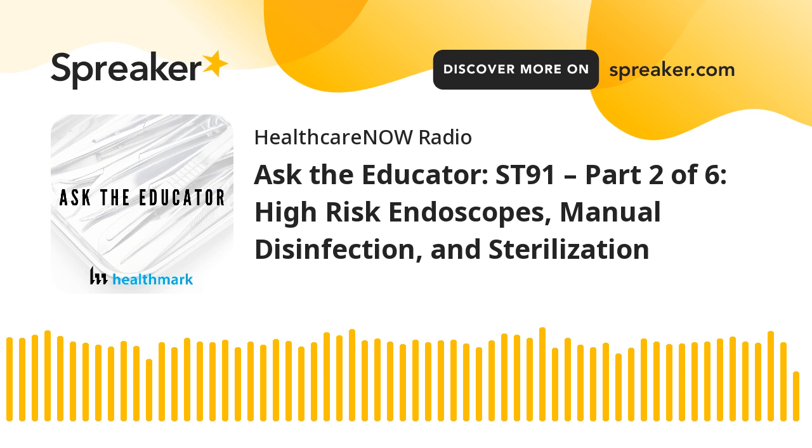They are often of more complex design than other simpler types of endoscopes. So again, those that are more commonly associated with outbreaks, those that are difficult to reprocess and therefore have that higher risk associated with them, or they're just more complex and therefore something could more easily go wrong in that processing. Those are really the three buckets that I like to think of high-risk scopes being put into.